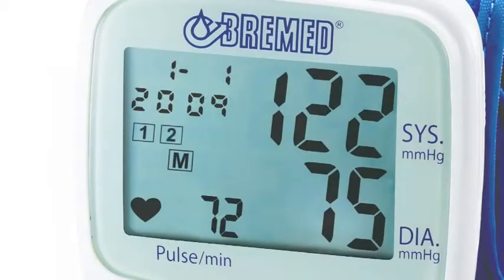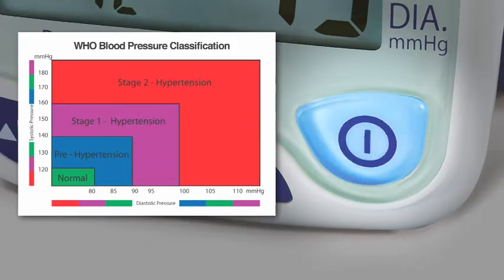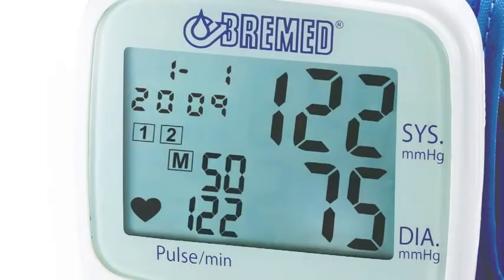It is ideal for taking blood pressure in a comfortable and easy way. The switching four-color LED — green, blue, purple, and red — automatically indicates the blood pressure classification according to WHO guidelines, so you can clearly understand your blood pressure status.